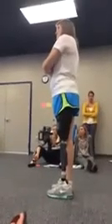Some of the steps were a little bit longer. It is pretty symmetrical, I would agree. It's pretty close. I think there are occasional steps she takes where the prosthesis just goes out a little bit more than this outline. Okay. What about her toe load and the heel rise?